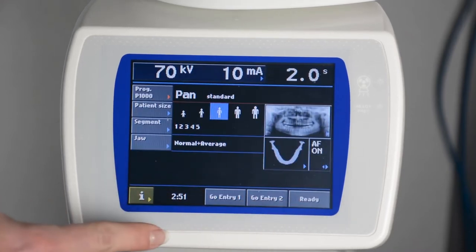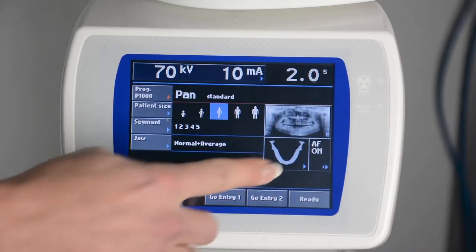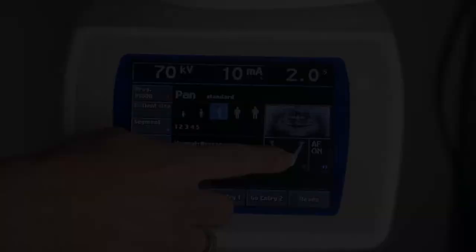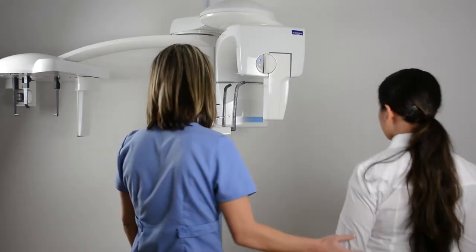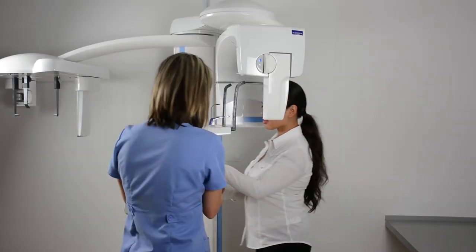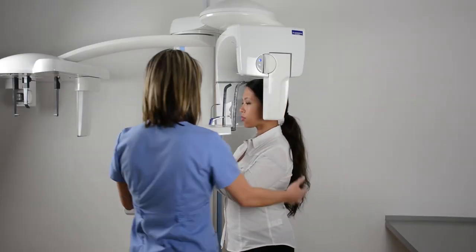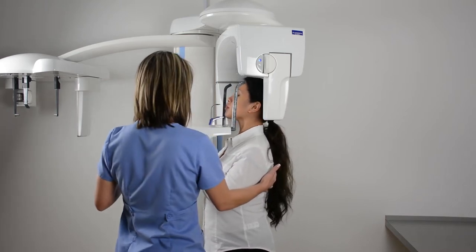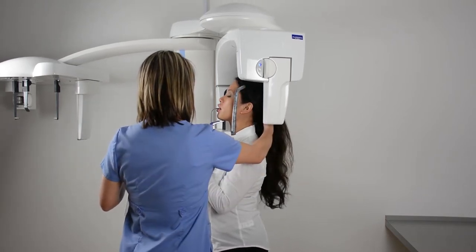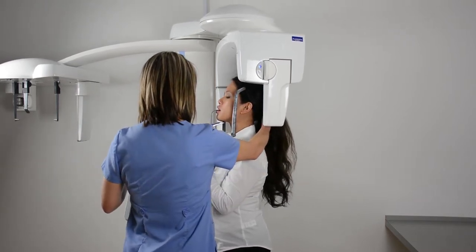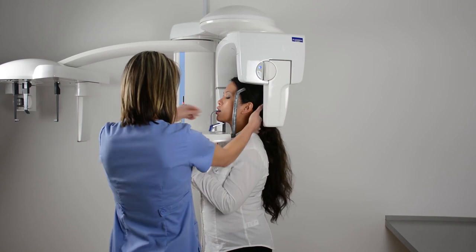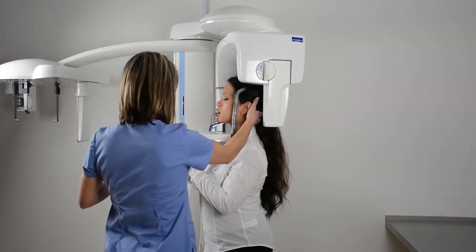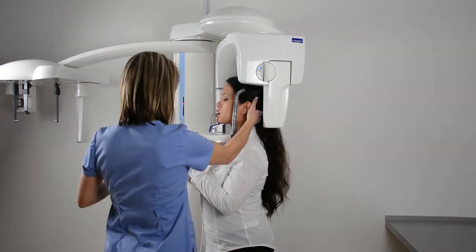Verify autofocus is on, then begin the positioning process. Have the patient stand tall, hold the handles, and walk close to the ProMax. Instruct the patient to bite into both grooves on the bite stick, then lower the bite stick so the patient's chin is resting on the chin rest.